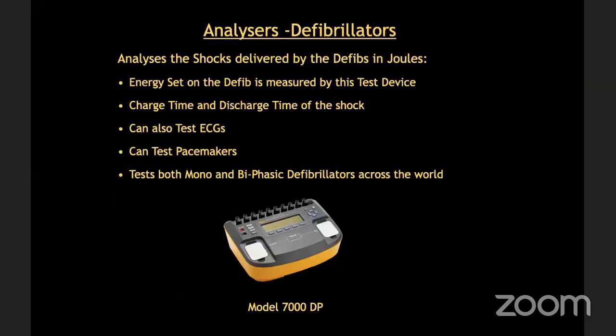Defibrillator analyzer is used to check the performance of the defibrillator, the set shock, whether it is delivered or not. What is the charge time? What is the discharge time? That is very important. When one shock is delivered, it cannot take another 5 minutes for the second shock. It should charge immediately.